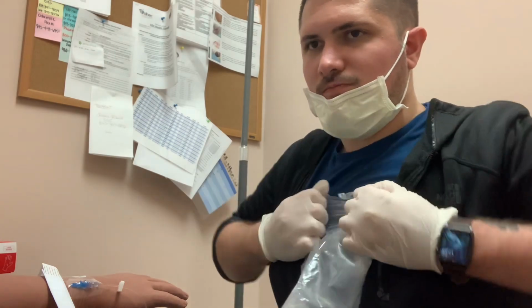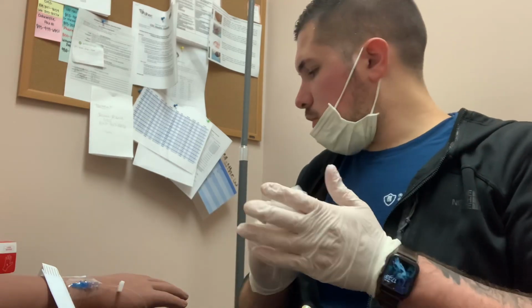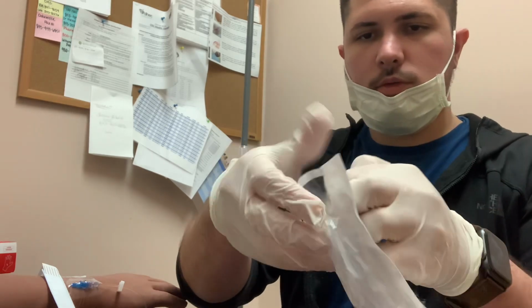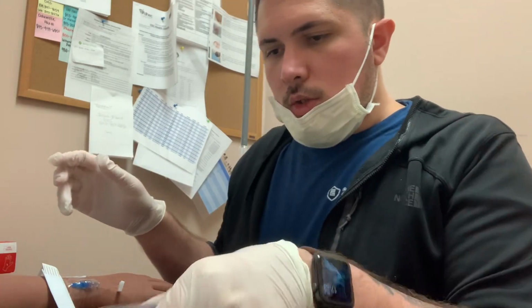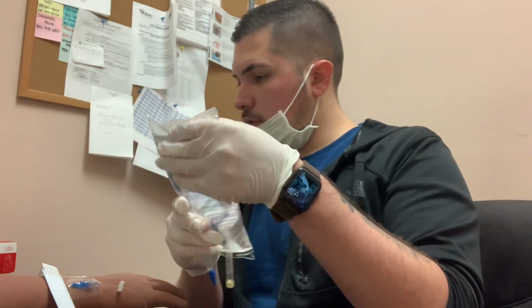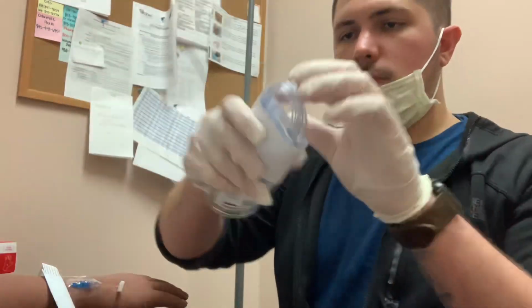Open. I'll throw this in the trash. And we have our tubing. Alright. So now we're going to double check one more time. 500, 500. And it's within date. So we're going to get out our tubing.